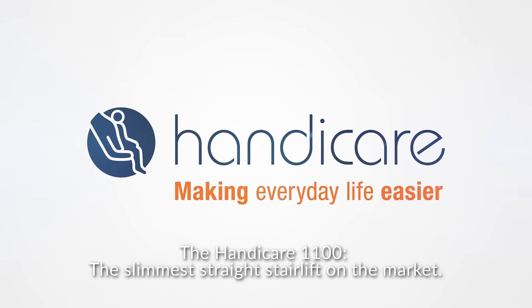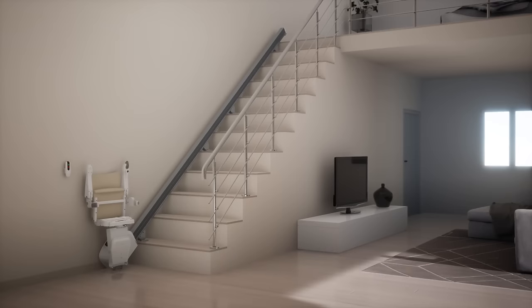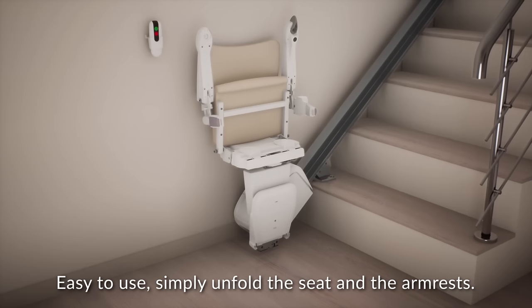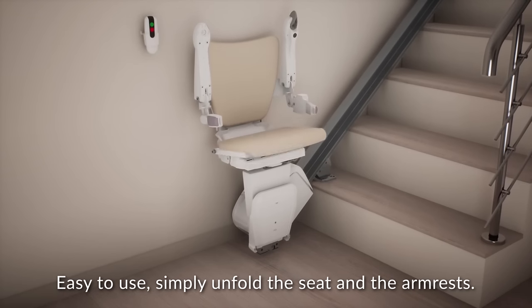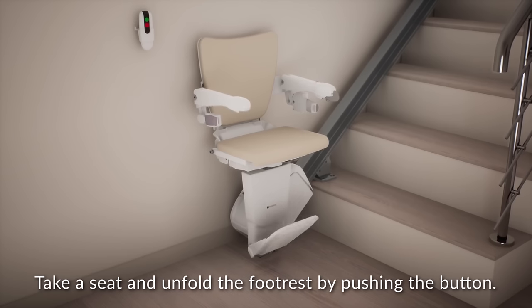The HandyCare 1100, the slimmest straight stairlift on the market. Easy to use — simply unfold the seat and the armrests. Take a seat and unfold the footrest by pushing the button.